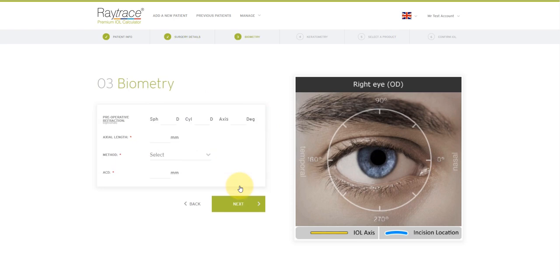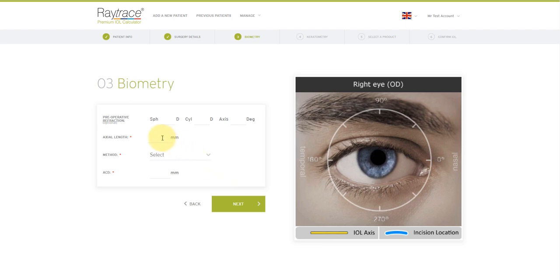For biometry, the required information depends on whether it's a capsular bag calculation or a supplementary lens calculation. In this case, we've selected capsular bag lens. Adding the pre-operative refraction is optional. You do need to add the axial length for the eye in millimeters. So I'm going to type in 24.32.